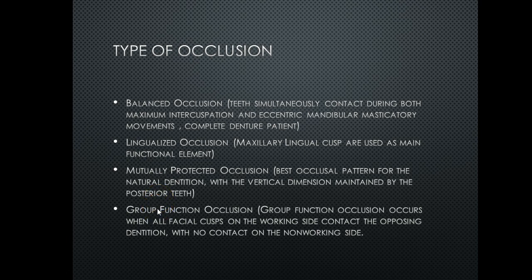The more traumatic loading you have on your implant, the more likely you end up getting crestal bone loss or even dislodgement of your prosthetic itself, depending on whether it's screw or cement retained. But regardless, it has an internal weakness to be dislodged if it's traumatic occlusion.